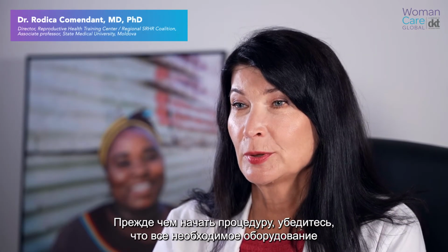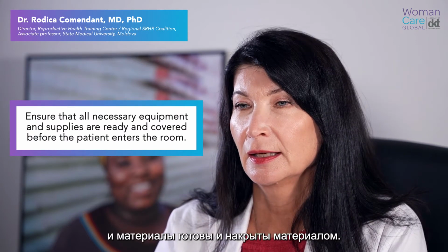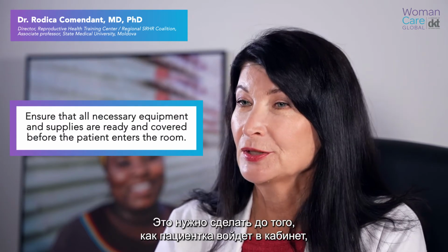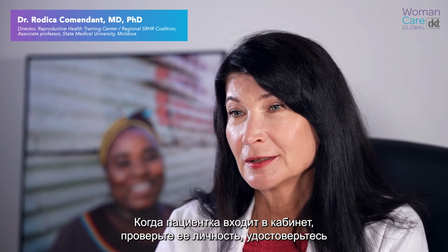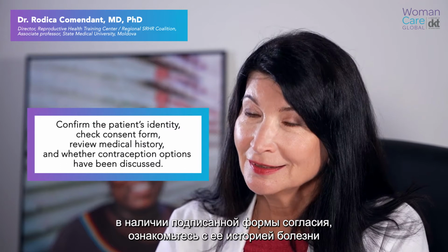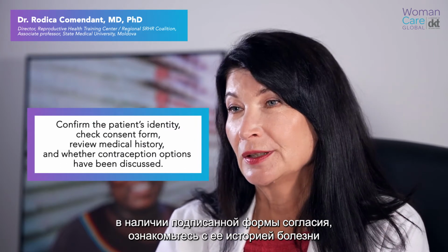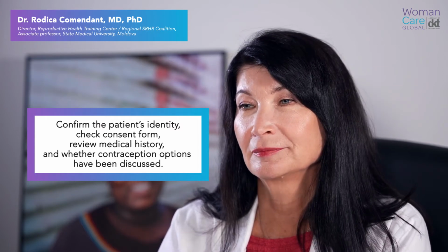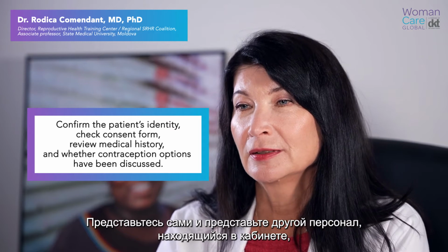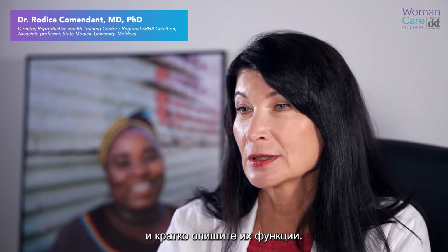Before starting the procedure, ensure that all necessary equipment and supplies are ready and covered before the patient enters the room to reduce anxiety. When the patient enters the room, confirm her identity and check whether a consent form has been signed, review her medical history, and whether contraception options have been discussed. Introduce yourself and any other staff in the room and briefly outline what their roles are.